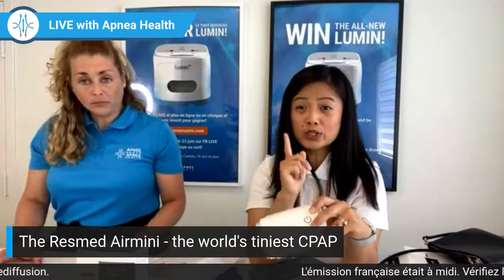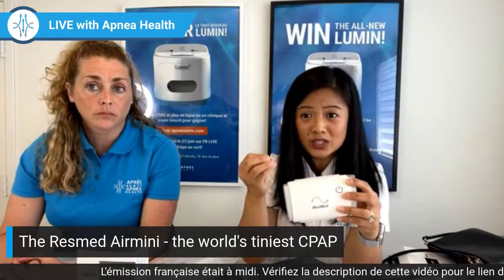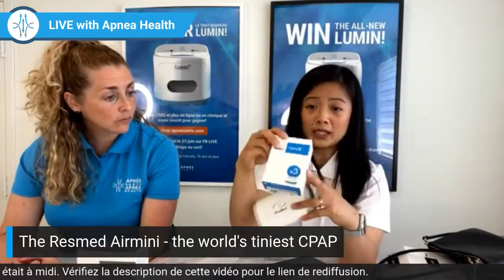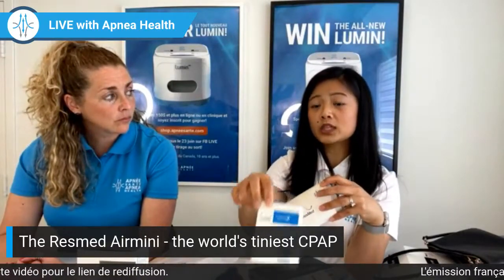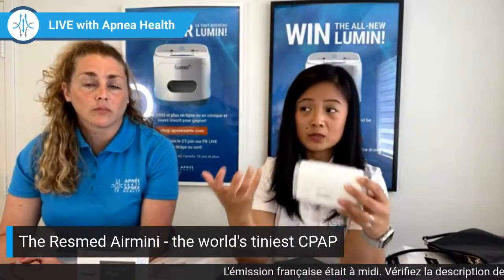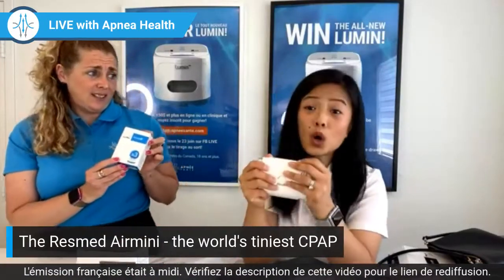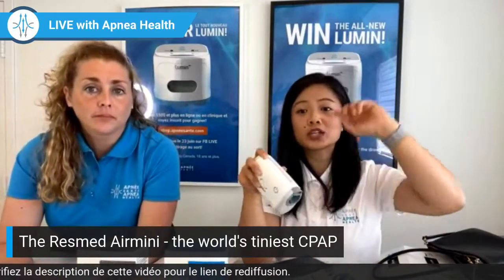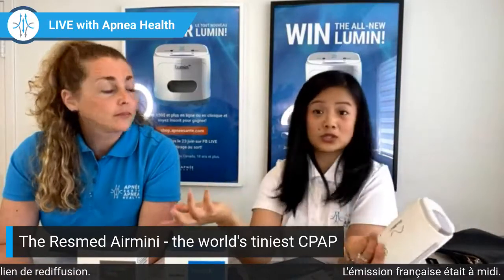If you were there on our first live, we spoke about how humidity is a comfort setting. And with CPAP, comfort is everything. I did say the Humidex is a good alternative, but it won't give you the same level of humidity as a heated humidifier. So if we're talking about comfort, you're much more comfortable with the heated one. You can't really adjust this. With a CPAP humidifier, you can adjust the level of humidity, you can adjust temperature, more options.